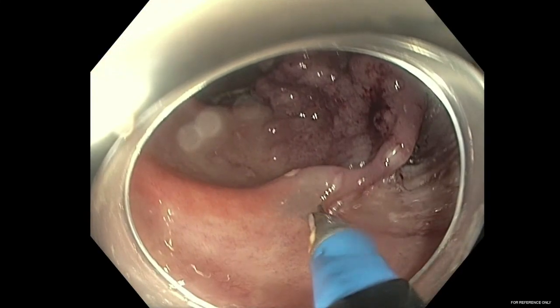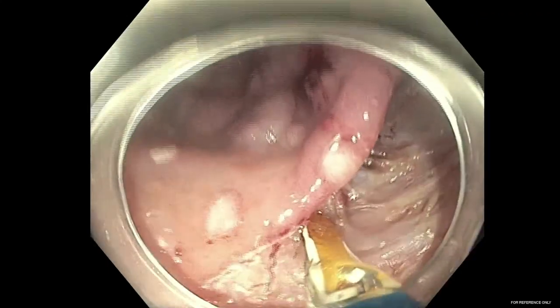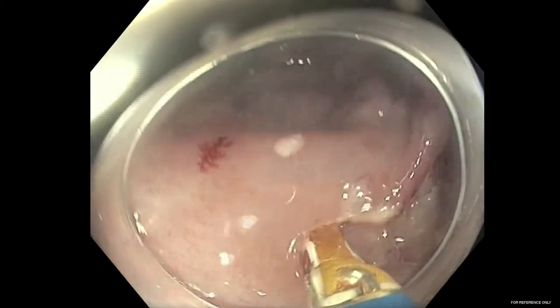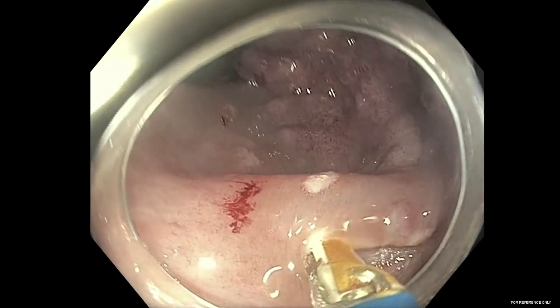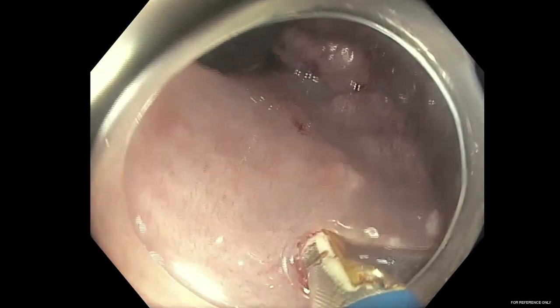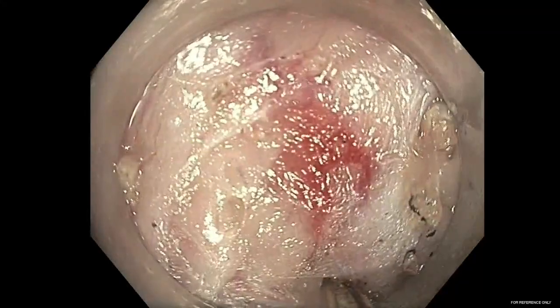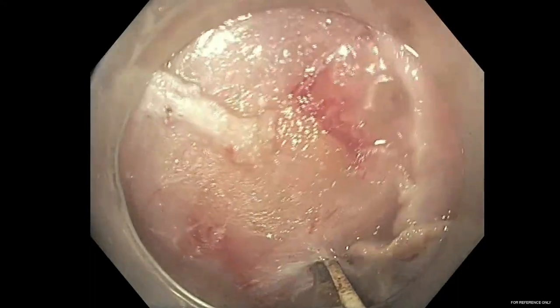Next, we perform the lateral mucosal incision and submucosal dissection at the anti-gravity side, first by again injecting using the 26-gauge retractable needle with hetastarch solution. After a lift is performed, submucosal dissection is performed again using radiofrequency energy with careful microwave coagulation of underlying vessels. This process is continued until complete dissection is achieved, utilizing the effect of gravity to decrease the complexity of dissection.